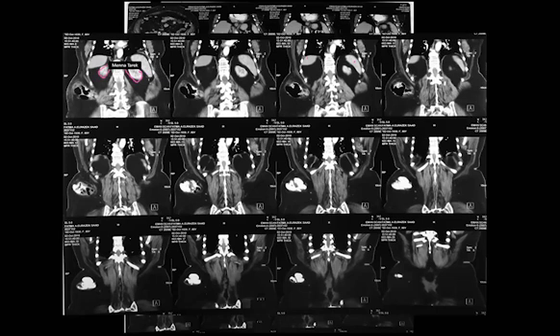Yes, this is the kidney and this is the other one. Absolutely. Where's the spleen? ده السبلين. فين السبلين؟ انا مش شفت اهو. وطبعا the liver is on the other side.